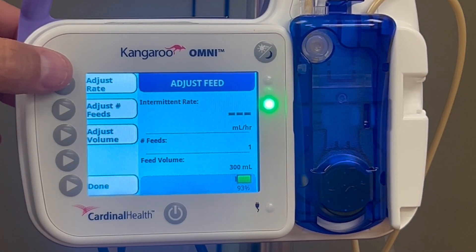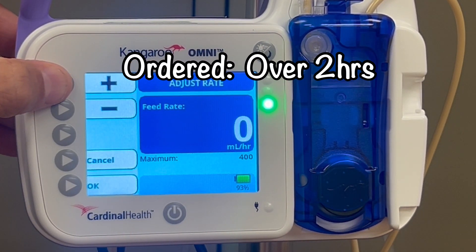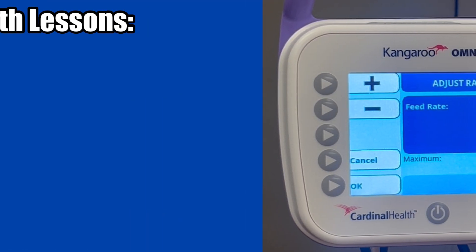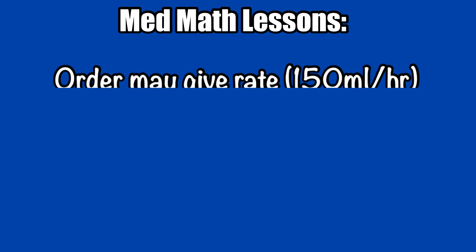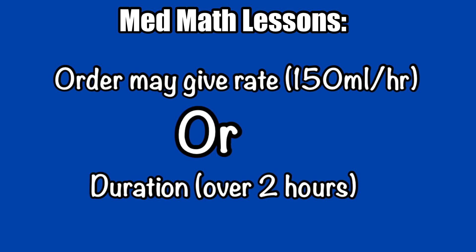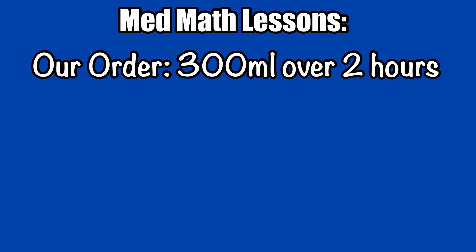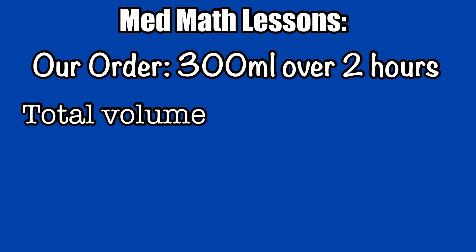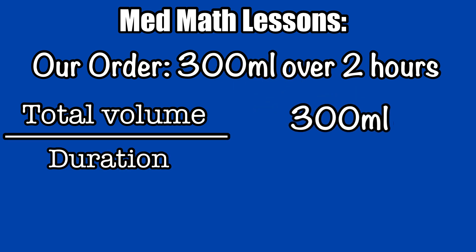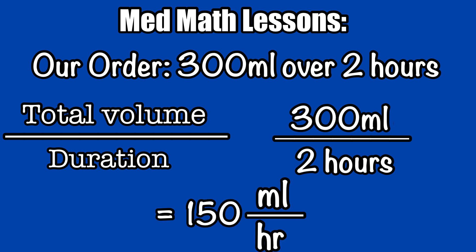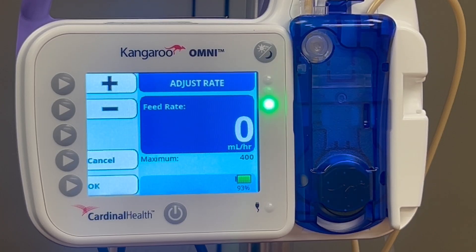Next, push Adjust Rate. Our order said to administer this bolus over 2 hours, which isn't giving us the rate directly, but we can figure it out. Some orders may specify the rate, but if it only gives you duration, you'll have some math to perform. If we need to deliver 300 milliliters over 2 hours, divide the total volume in milliliters — 300 — by the duration of the infusion in hours — 2. This gives us 150 milliliters per hour. That's our rate. Input that value.